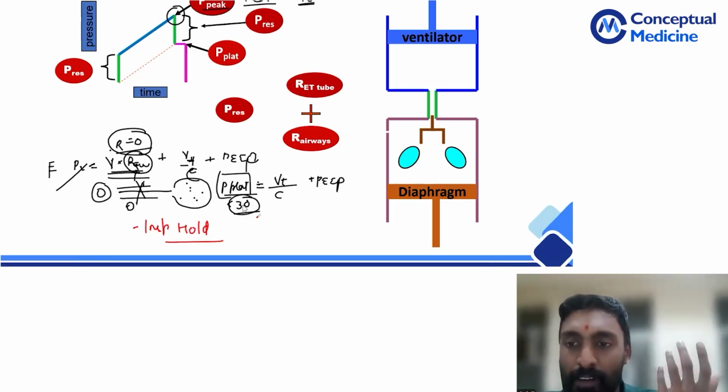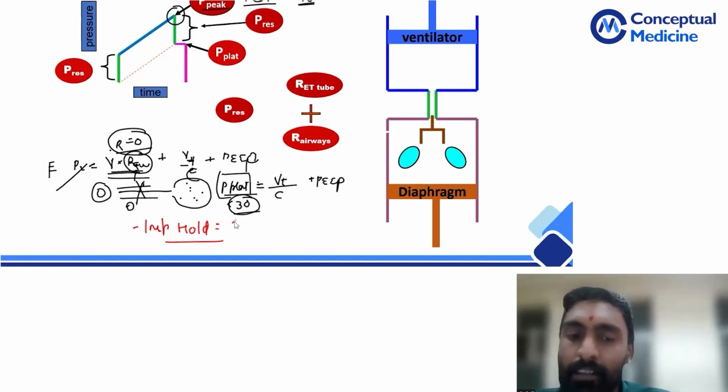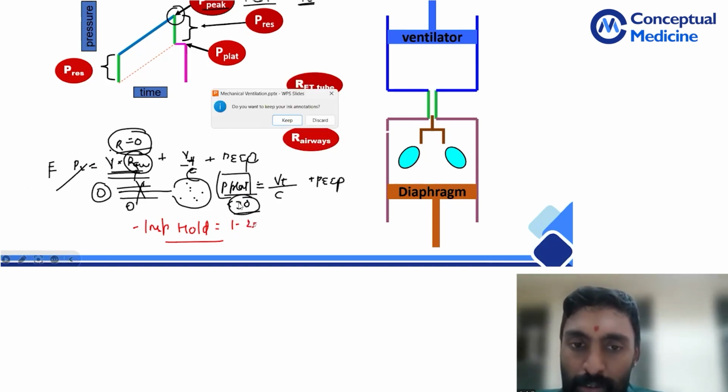Each ventilator has a different mechanism. You should be well versed with how to do it on your ventilator. This is there in every ventilator. You'll do it for 1 second. 1 to 2 seconds is the maximum that you should do it for.